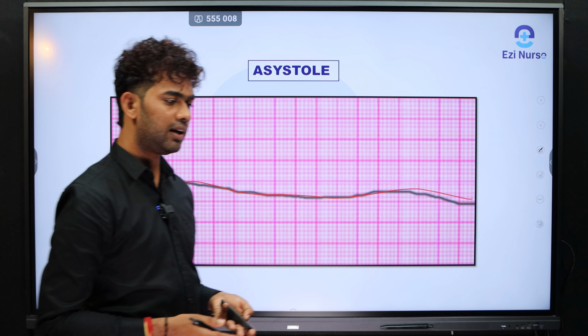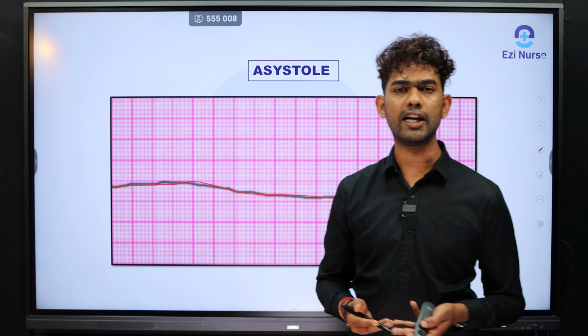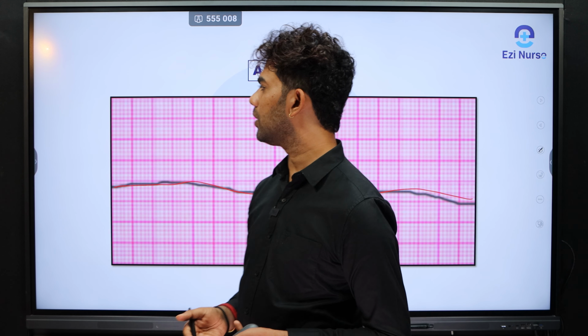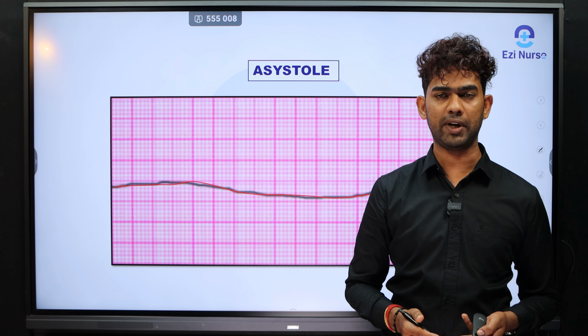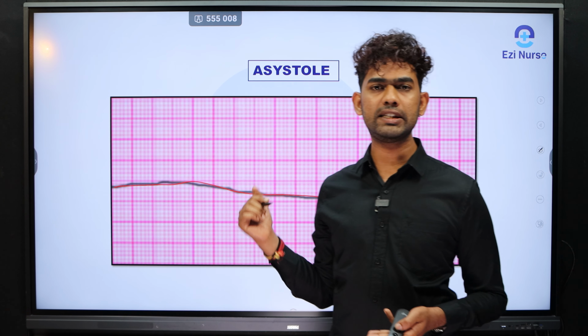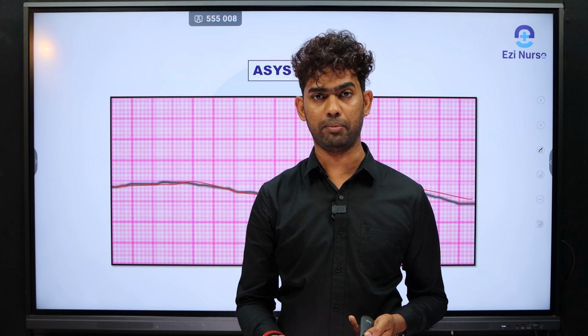Okay, so we already discussed atrial fibrillation, atrial flutter, pulseless ventricular tachycardia, and ventricular fibrillation. Here the pulseless ventricular tachycardia and ventricular fibrillation, these two rhythms, we can call shockable rhythms. When we get these rhythms, we should deliver the shock using the defibrillator.